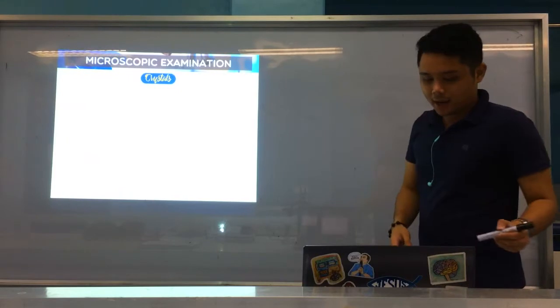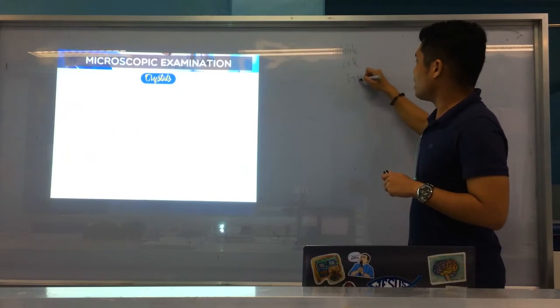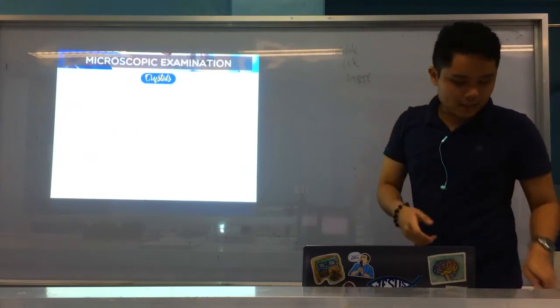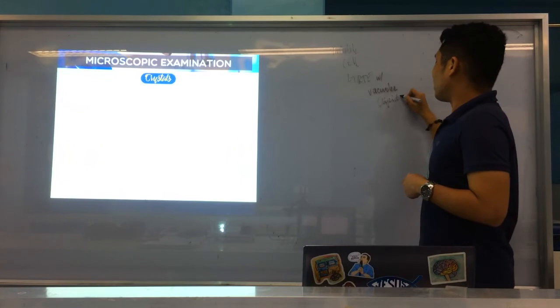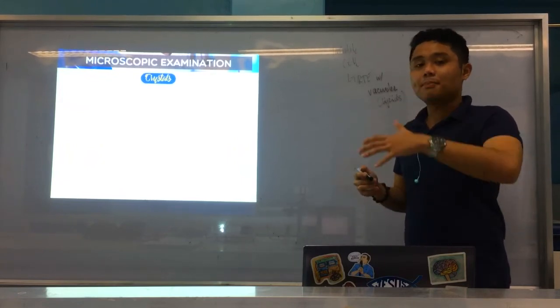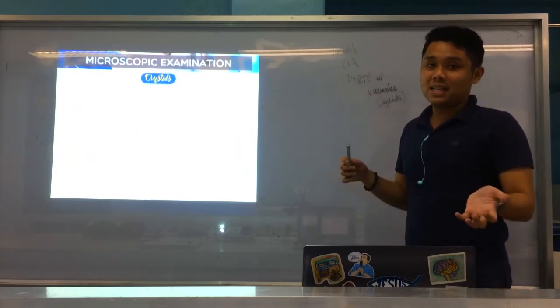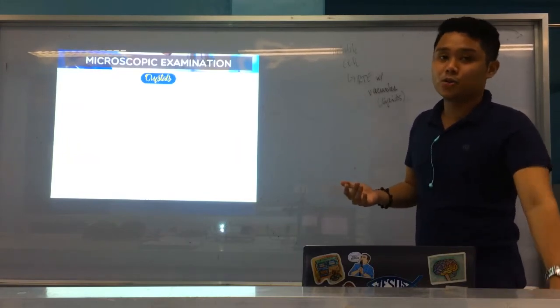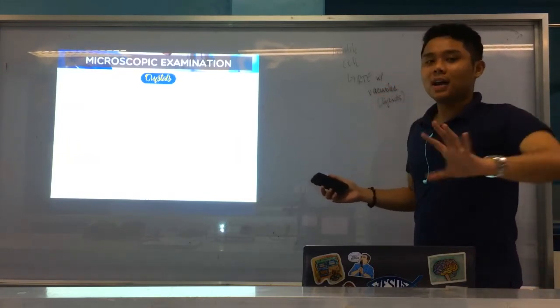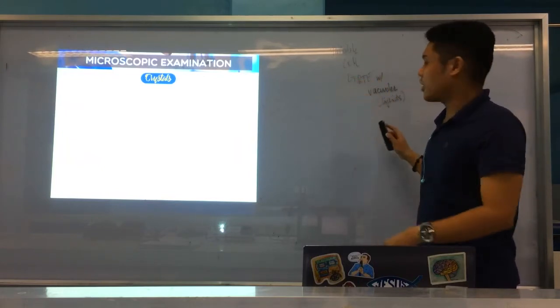Your bubble cell. What do you mean by a bubble cell? A bubble cell is an RTE with vacuoles, but the contents of the vacuoles are not lipids. So a bubble cell is an RTE with non-lipid vacuoles, or if it is lipid in the RTE, that is called oval fat bodies. But a bubble cell is an RTE with vacuoles whose contents are not lipid. Please take note. These are just additional points, write them in your notes on RTE. Okay, all right. Sorry.